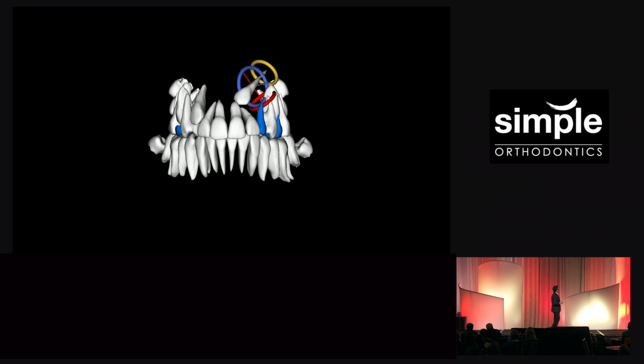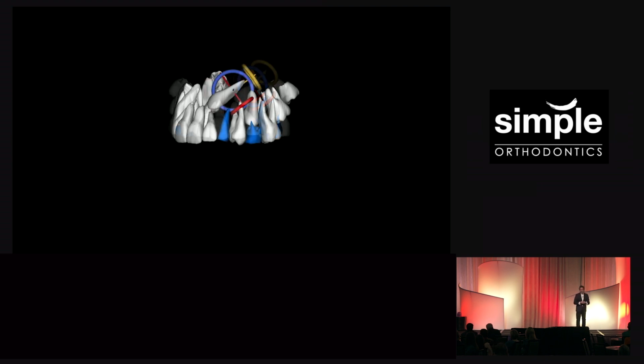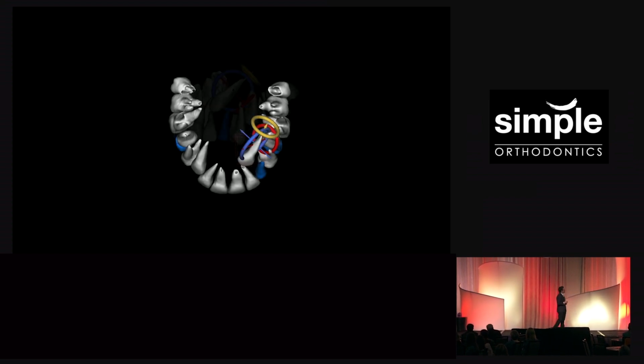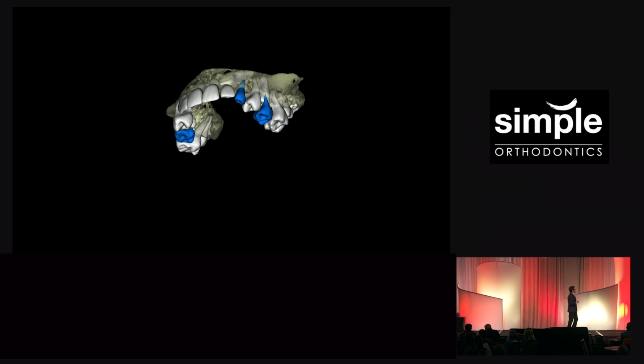Now, in Jesse's case, you can imagine if I pull in the direction of that canine site, I'm going to pull it right into the apex of the lateral. I don't want to do that. This tooth needs to move completely buccally. It can't go occlusal. That's going to get me into really big trouble.